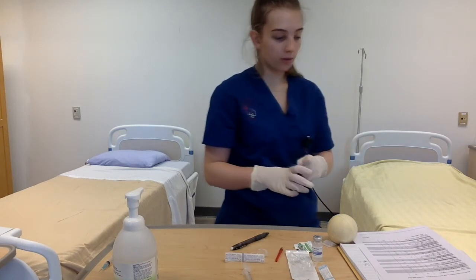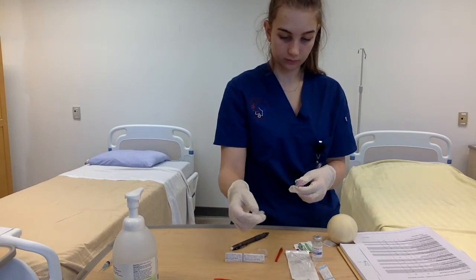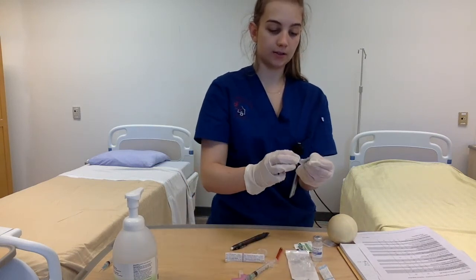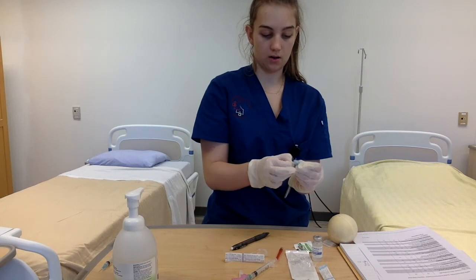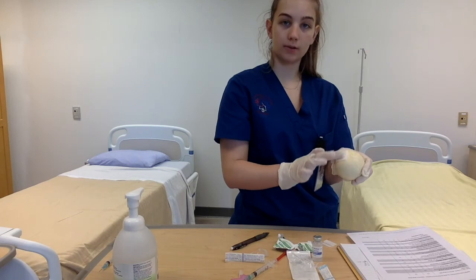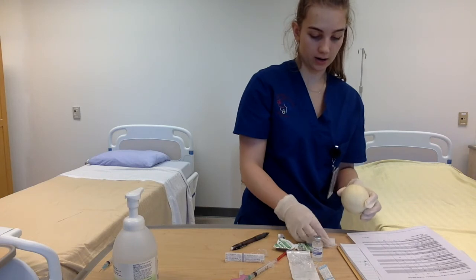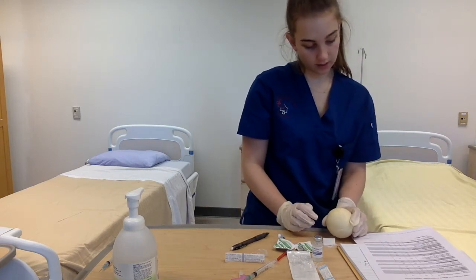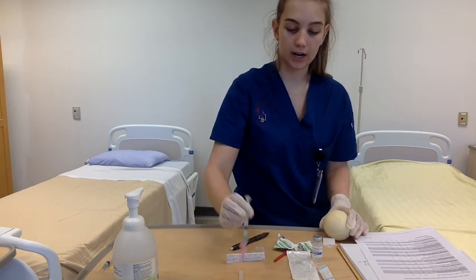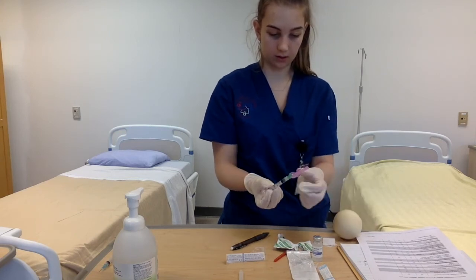So I'm just going to get my needle ready and uncap it. And I also need to, once again, cleanse the area that I'm going to be giving the injection. So I'm using an alcohol swab to do that. Okay, now that the area is cleansed, we're ready to give the injection. So for this injection, we can just give it straight in at 90 degrees. We're going to get this out of the way.